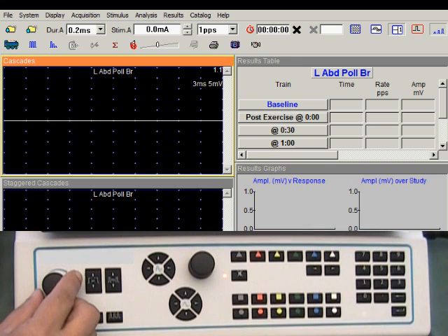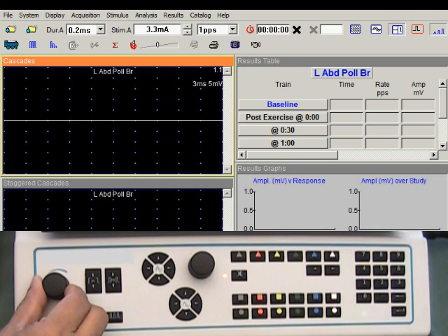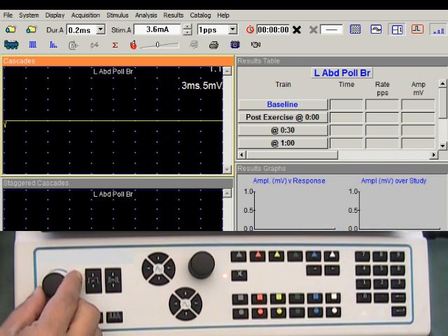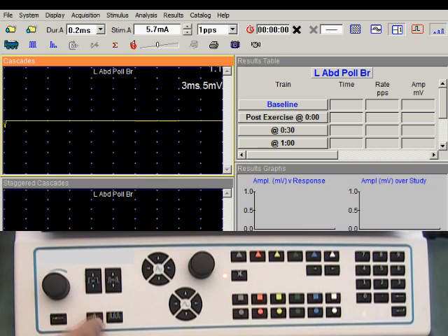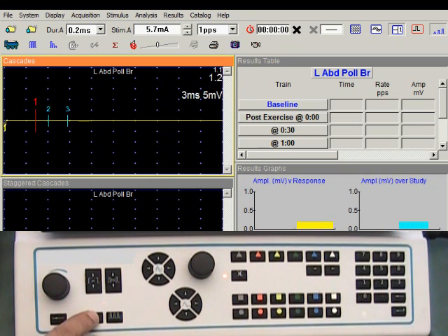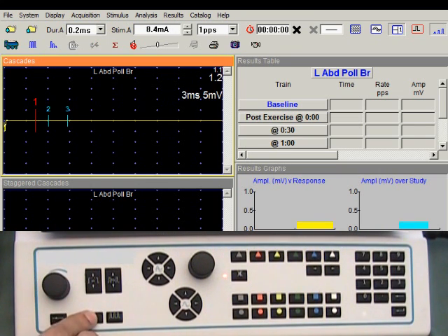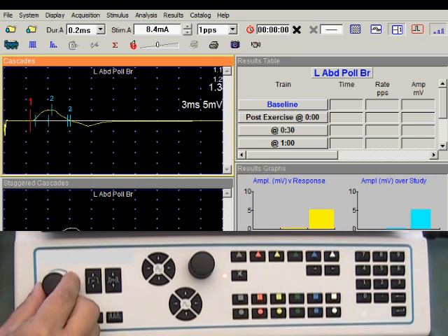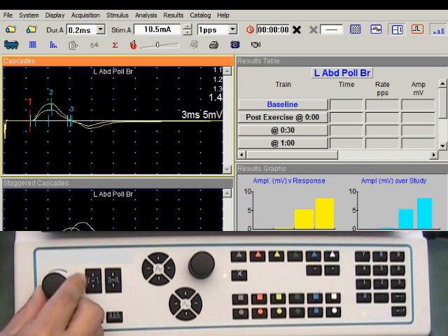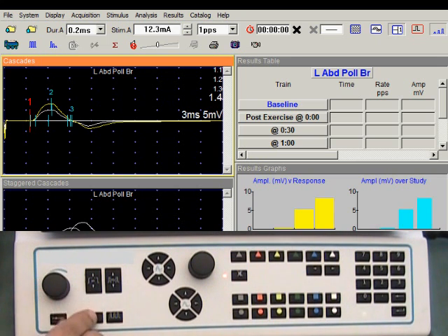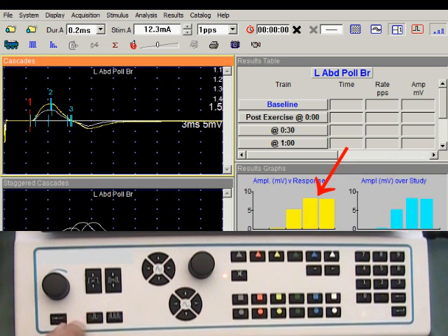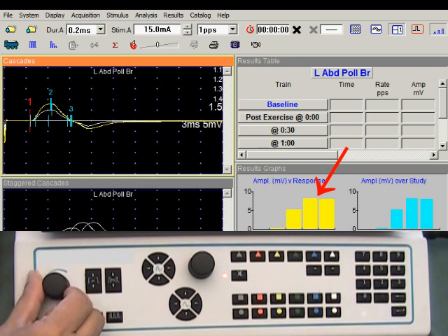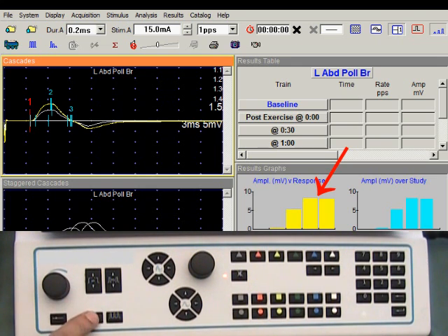I will increase the intensity gradually to reach the supramaximum level. The response did not change, so this is maximal intensity. Increasing it further to reach supramaximum level.